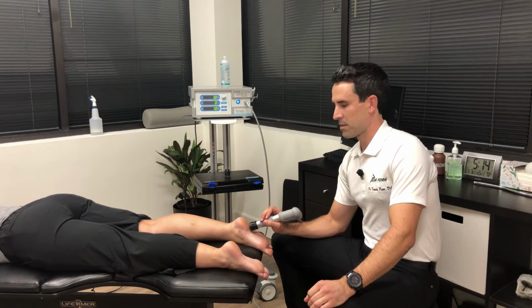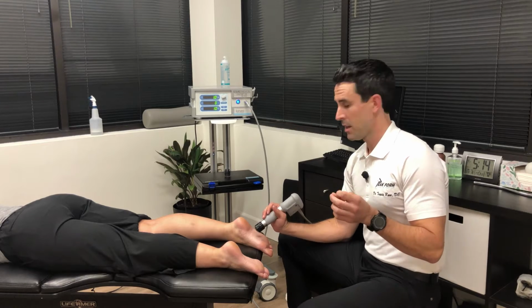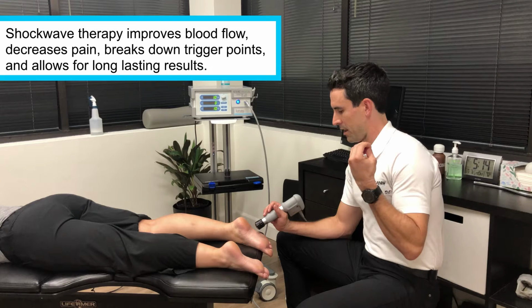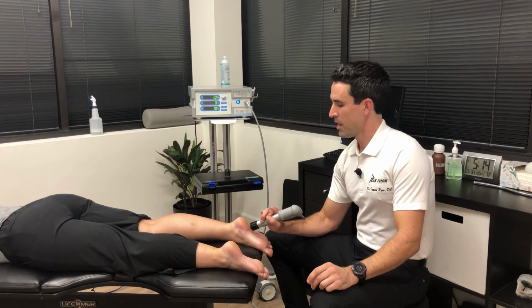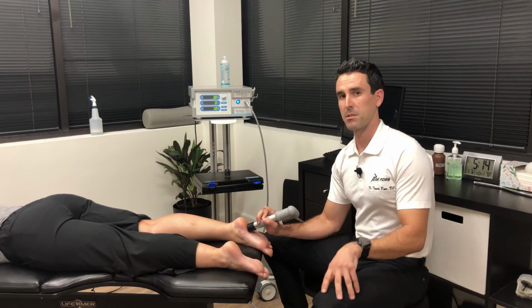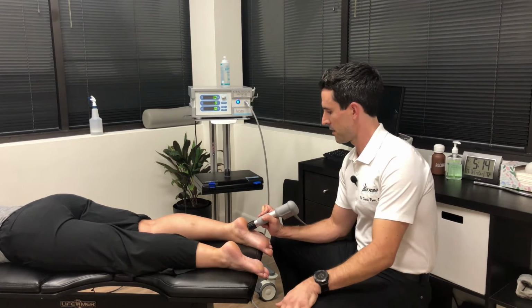The other thing in chronic pain syndromes is that there's some buildup of a neurotransmitter called substance P, which then will elicit the pain response in the area and send the activation up those pain fibers up the body. So by doing the shockwave approach, we can decrease the amount of substance P in the area to help decrease the amount of pain sensitization in the area.